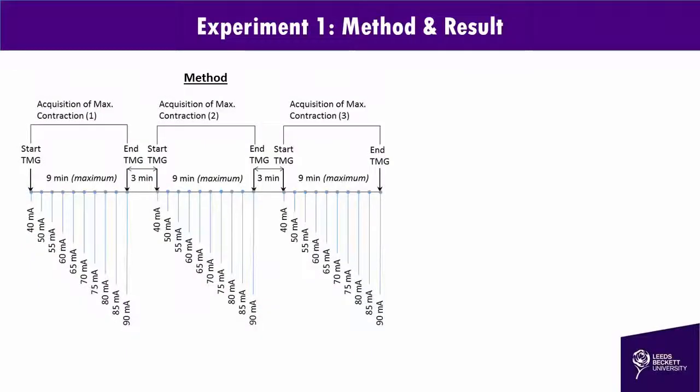So this is the method for the first study. This is the one where we're looking at the amplitude required to achieve maximum contraction. You can see here, this is one block. So I did do stimulations before 40 milliamps. I actually started at 20, but here I've just put on 40. And I stimulate every minute, so I'm leaving a really long interstimulus interval between consecutive stimulations here. And then a nice washout period in between. So I'm stopping anywhere in here when I'm getting to maximum displacement, giving the washout period and repeating the whole process.